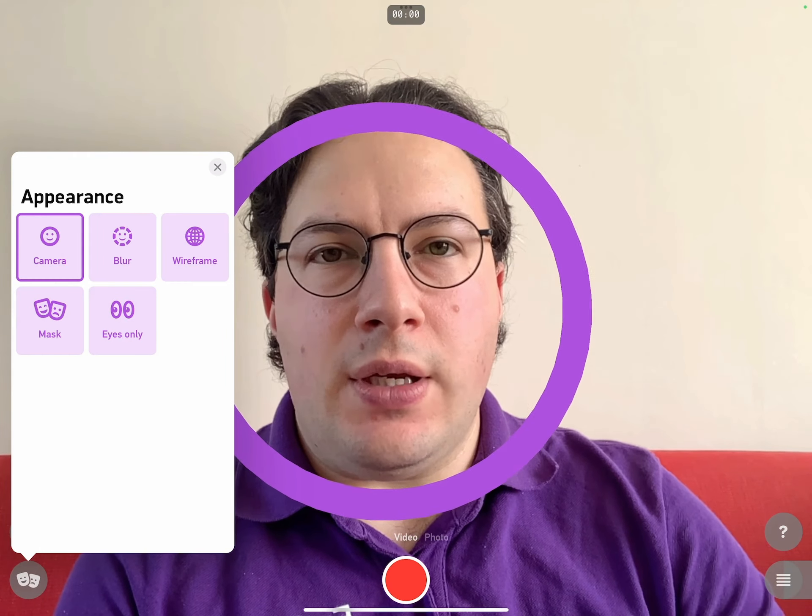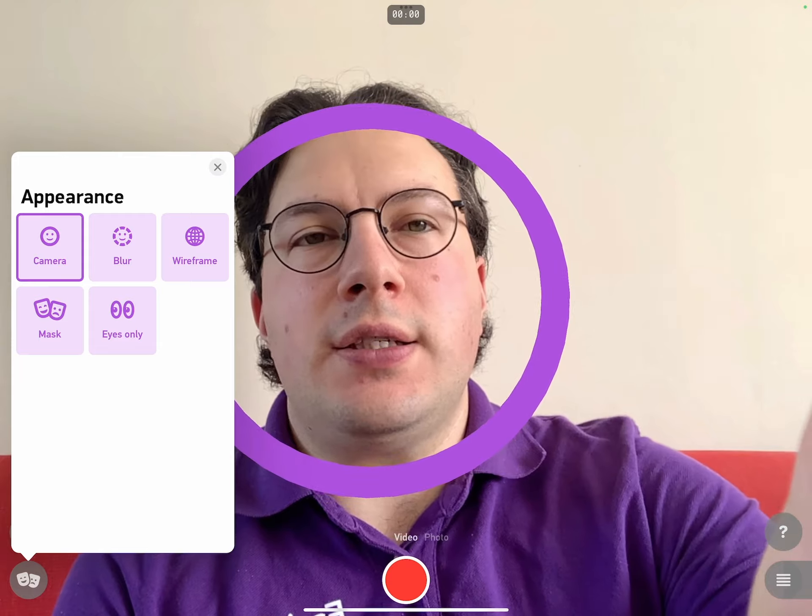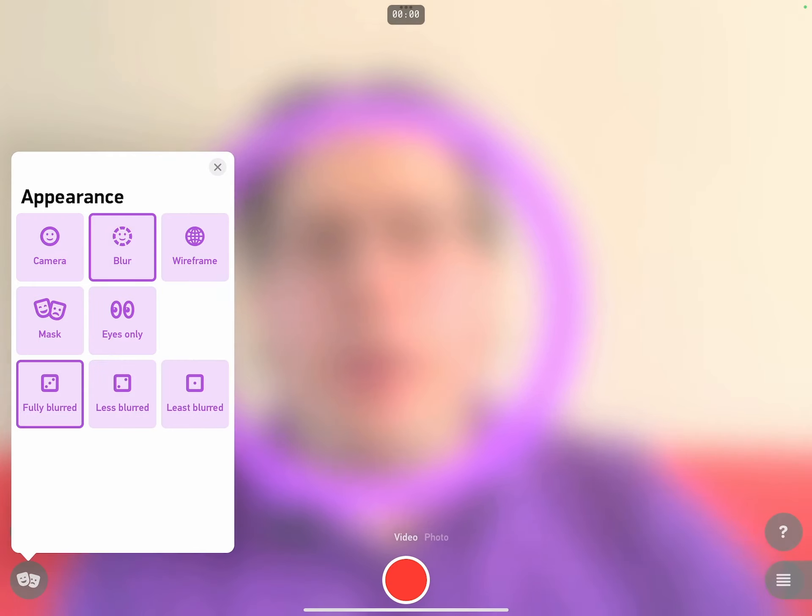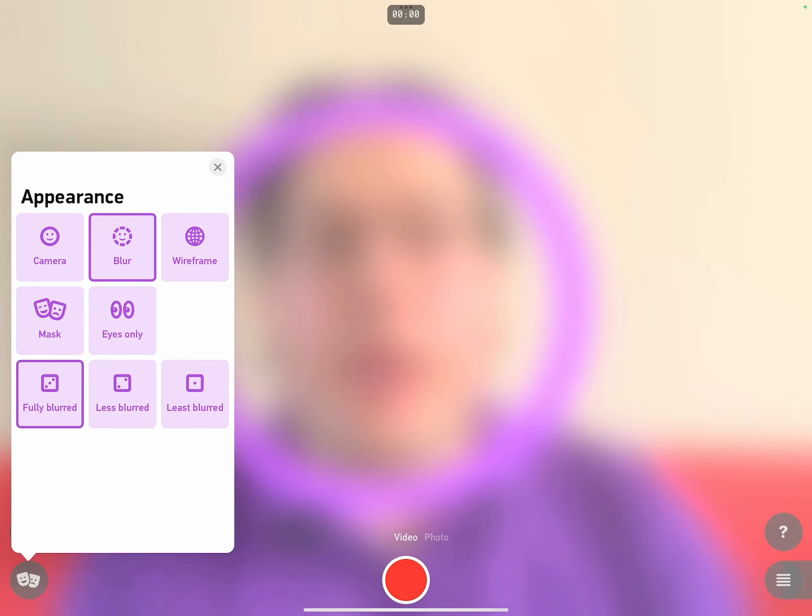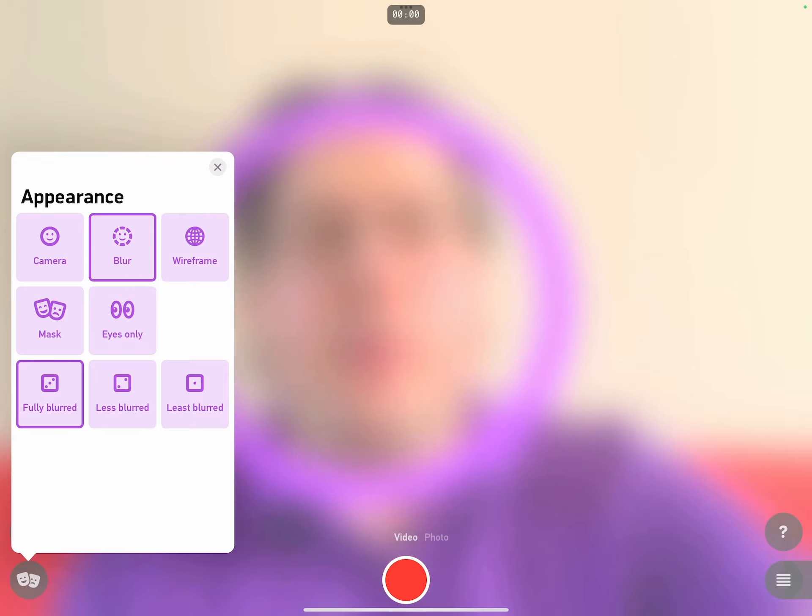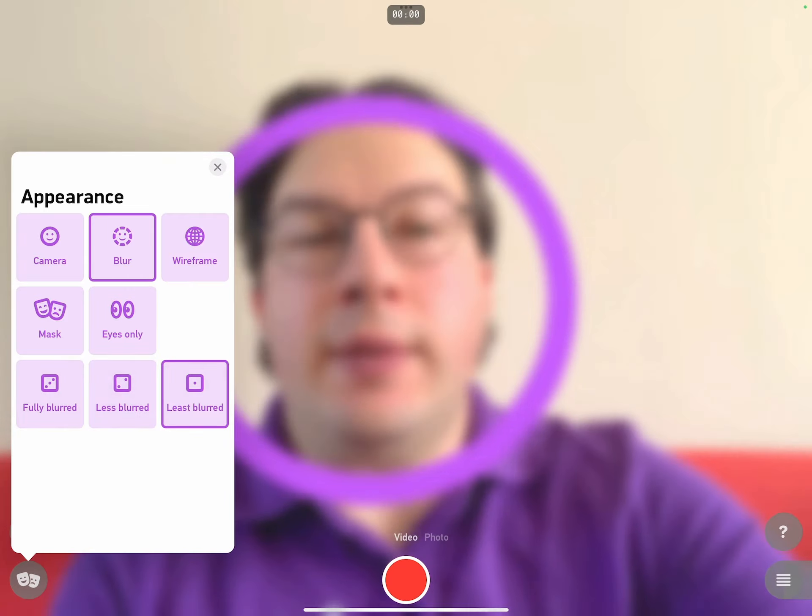Now the last thing I'd like to show you is a feature designed to encourage people to use the app if they're uncomfortable with their facial appearance. I can tap on this little button in bottom left and bring up the appearance menu. And then I can tap on blur. And this blurs my appearance, so I can't see my face quite as clearly. I can even choose how much blur I want.